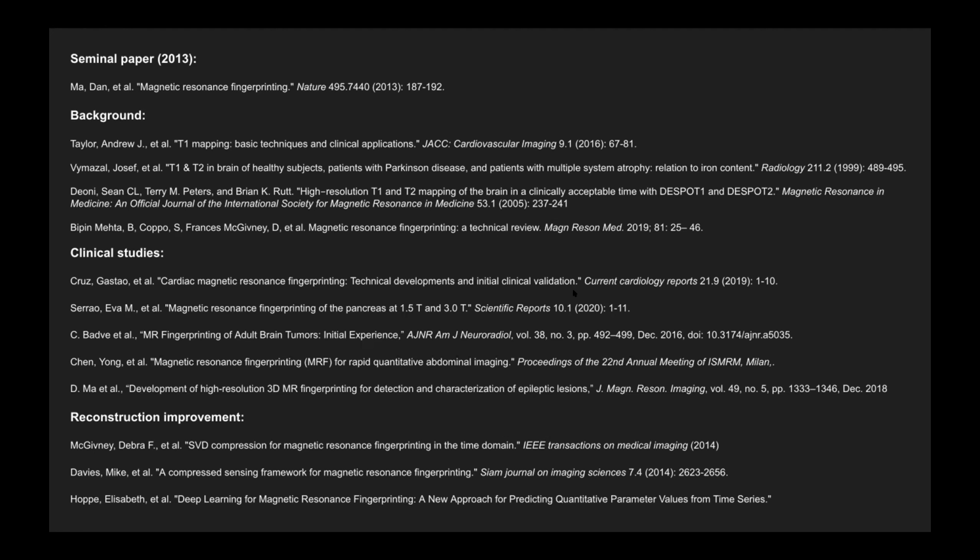A lot of the reason that normal scans can take a long time is because they're trying to isolate a single parameter. So you have to wait for something to decay or wait for something to recover. But because MRF is mixing it all up, it can actually be fast. And to add to that, you can also get more signal because you're not waiting for certain things to happen. As soon as you flip, you can start your spiral sequence, right? And so that also is a big help. Cool. That's really interesting.